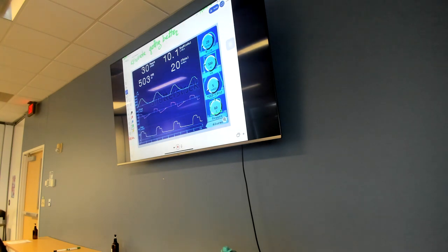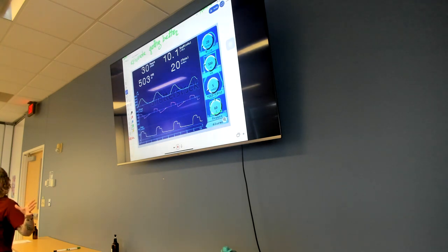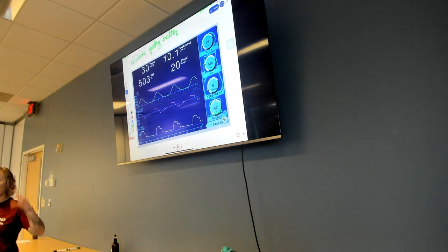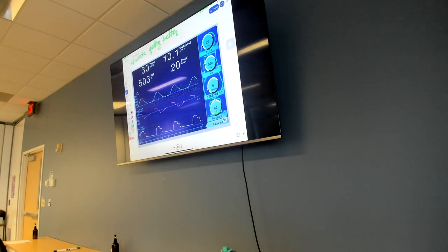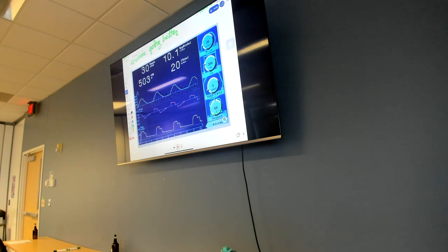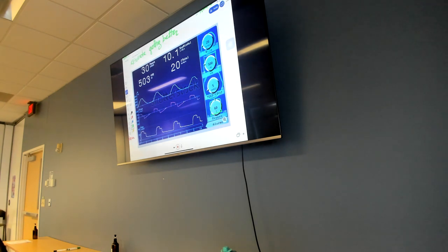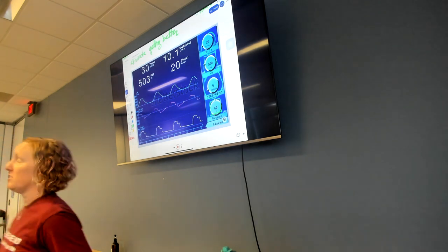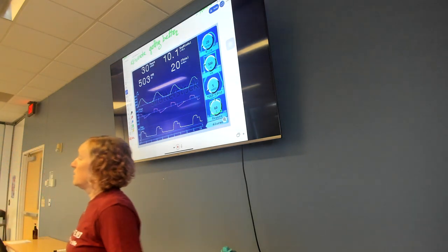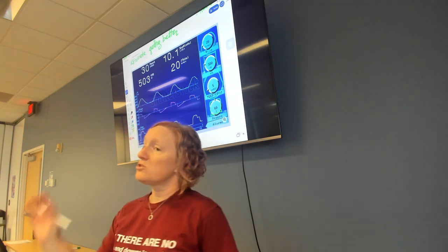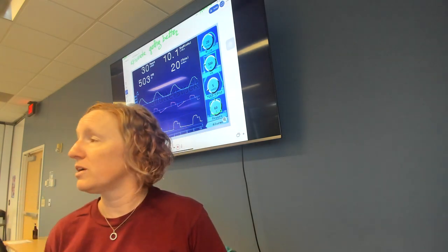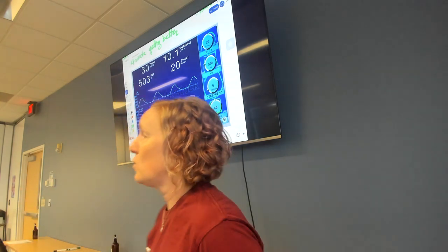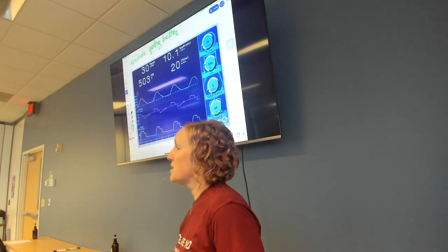Right, yep. See, it said it's VT there. I'm like, I don't know why they do that. So, yeah, you got your nice tidal volume is 500. So this is probably a pretty tall person or they've got good lung compliance. Yep. So your FiO2 is 60%, so that's a little on the high side, right? Like, who knows? Maybe they just, you know, maybe they're coming down. Again, that's where our trends get important. Like, if they were 80 yesterday and they're 60 today, that's better. If they were 40 yesterday and they're 60 today, we probably want to talk about that a little bit more. See what's going on, okay? Our breaths per minute is 20, okay? And I don't know, this one doesn't really have a mode on it. So, but that's what I want you to look at.